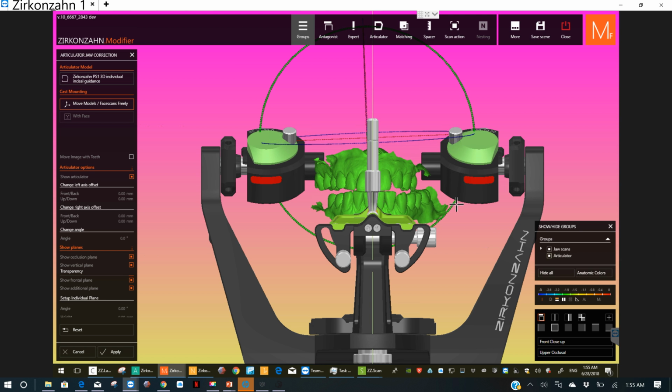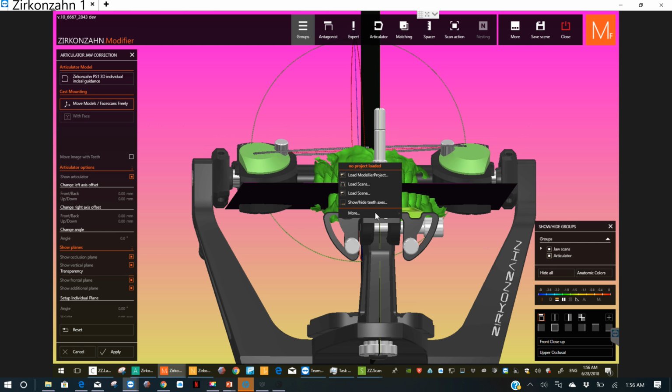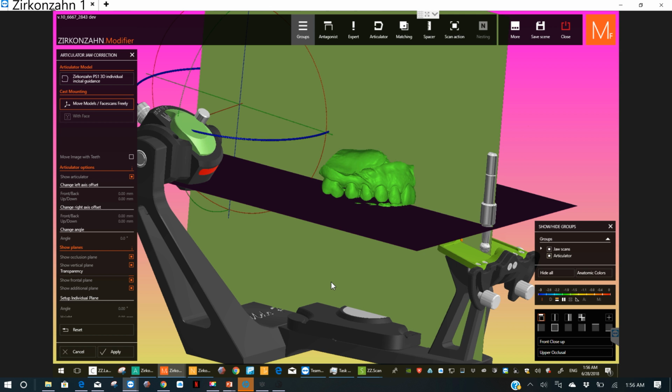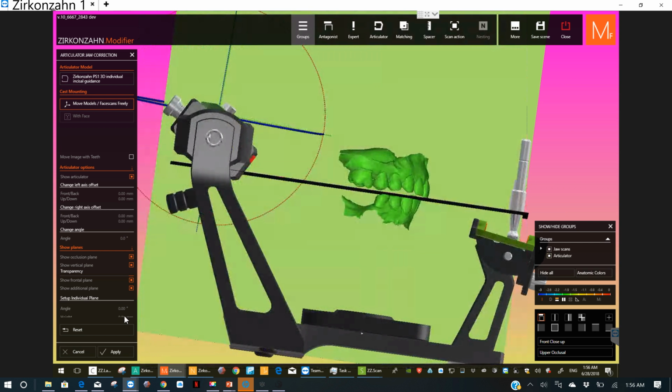Again, this part would be done if we spent the 2 minutes to get the little plane finder bite fork. You just stick the bite fork in the plane finder, put some bite material on it, have the patient put their head level and dip into the bite material. And then you scan that, and then that will line all this up. It would be pretty amazing. There's a spot for the bite fork in here. Okay, so that's good. I'm going to say that we're done with the cast mount now.